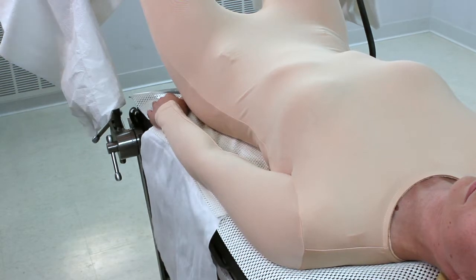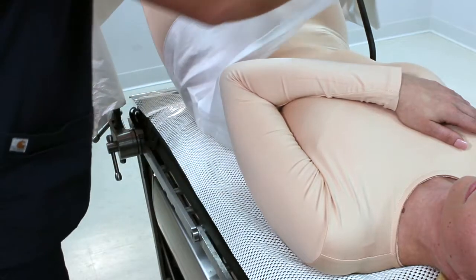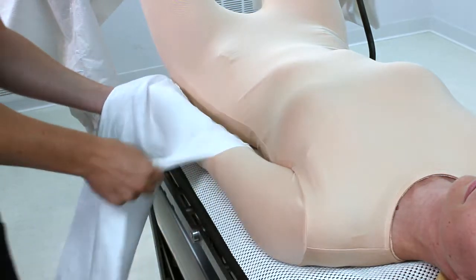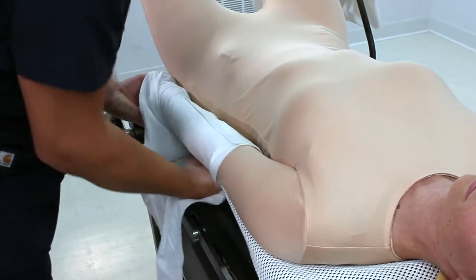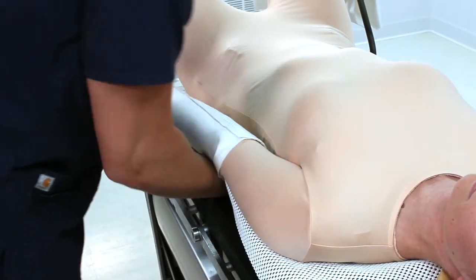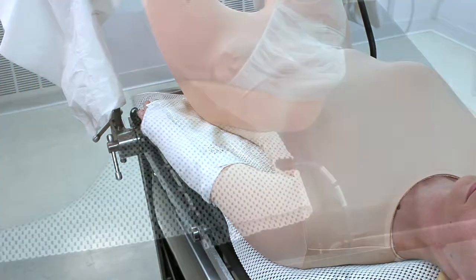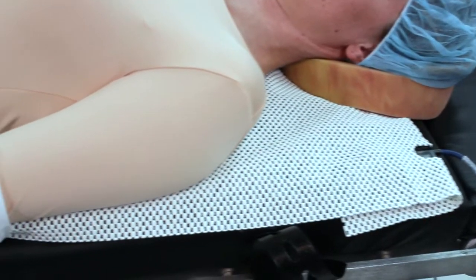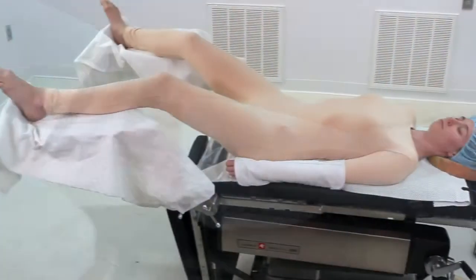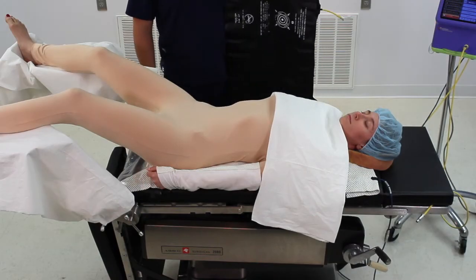Secure the arms using the draw sheet. The draw sheet goes up near the patient's torso, between the arm and the body, and then wraps around the arm. It is secured by tucking it under the warming mattress. Do not tuck the draw sheet ends between the patient and the waffle grip material, as this will decrease the friction contact surface. Do this for both arms. One hundred percent waffle grip to skin contact is required to ensure a secure hold with the friction and mechanical grip of the waffle grip pad, while still providing effective heat transfer from the Hot Dog warming mattress to the patient.